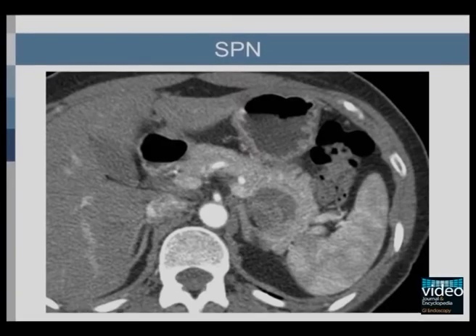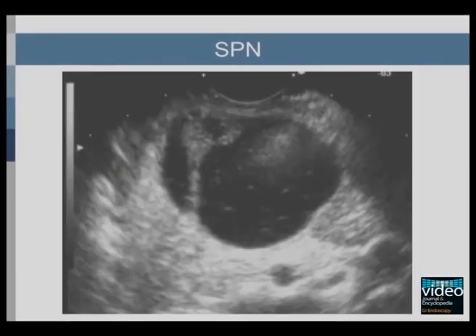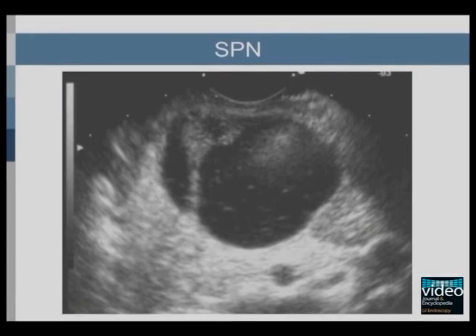A solid pseudopapillary neoplasm is seen on CT as a heterogeneous, partially solid and partially cystic mass. Calcifications may be seen occasionally, as seen on the CT of another patient. On EUS, solid pseudopapillary neoplasm may be solid, mixed solid and cystic, or cystic — here we see a cystic lesion with septation.